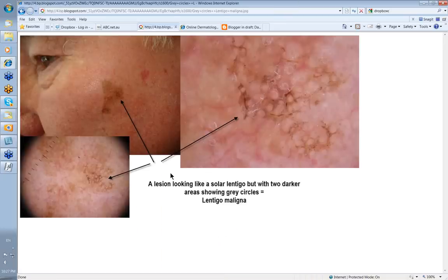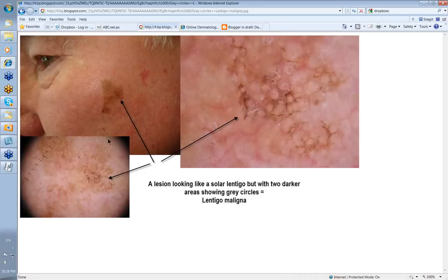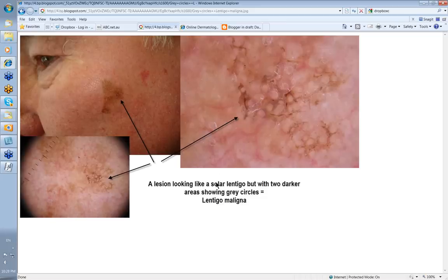Look at this pigmented lesion on a man's face. An ordinary solar lentigo would probably just be a uniform color, but when you have these variations of color within a pigmented lesion on the face, it's unlikely to be a simple solar lentigo — it's much more likely to be lentigo maligna. With the dermatoscope, you can see darker grey circles around the openings of the hair follicles. This lesion looked like a solar lentigo but with two darker areas showing grey circles. When those areas were histologically examined, it was lentigo maligna. The whole lesion needs to be excised in those circumstances.